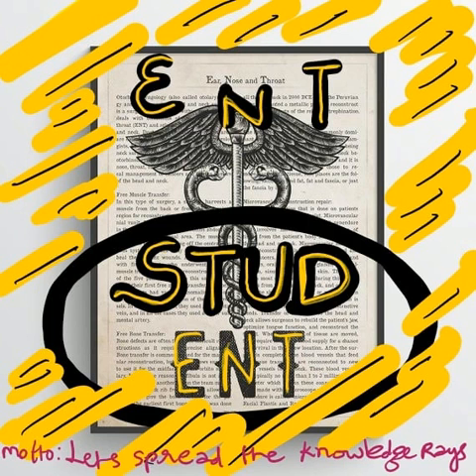in the region of the angle between the middle cranial fossa plate and posterior superior meatal wall, until the short process of the incus is visible lateral to the canal.